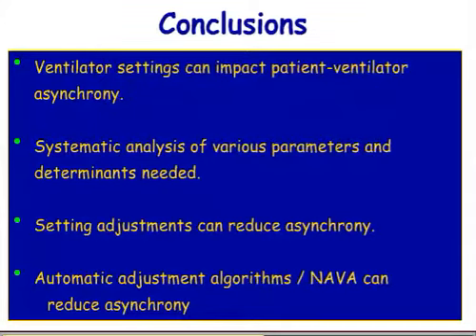Setting adjustments can clearly reduce asynchrony, and for now we mostly have manual adjustments based on our clinical judgment. And of course, automatic adjustment algorithms, such as SmartCare or NAVA, can reduce asynchrony, but we still don't know exactly what they can bring us in terms of patient outcome on a day-to-day basis. But so far, they are very interesting research tools.